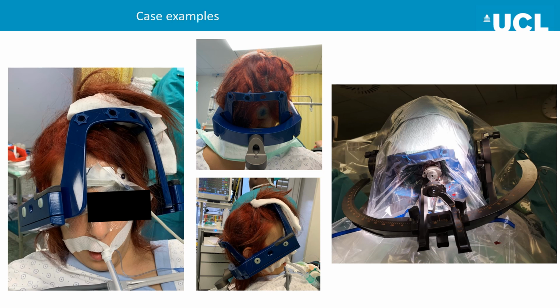And this is a concrete patient example. I think that was the first patient I operated with the Vantage for the posterior fossa. So it was a quite extreme angle, since I didn't know all the tricks at that point. It was possible though, but it can be difficult to get a CT scan actually, because you have to bend the neck quite a lot.